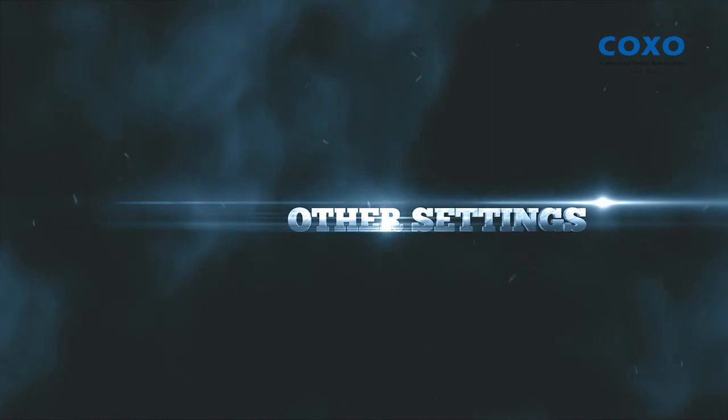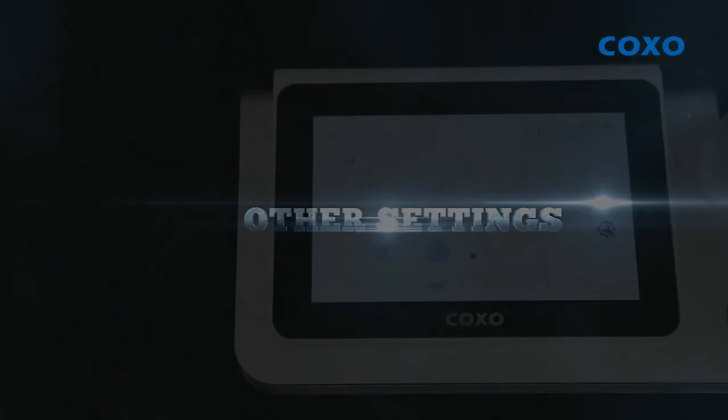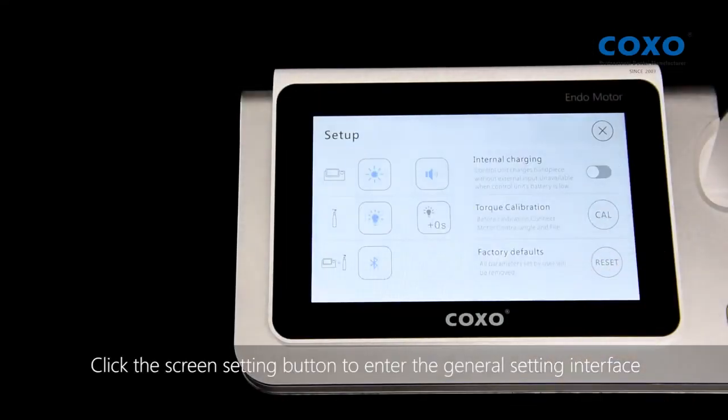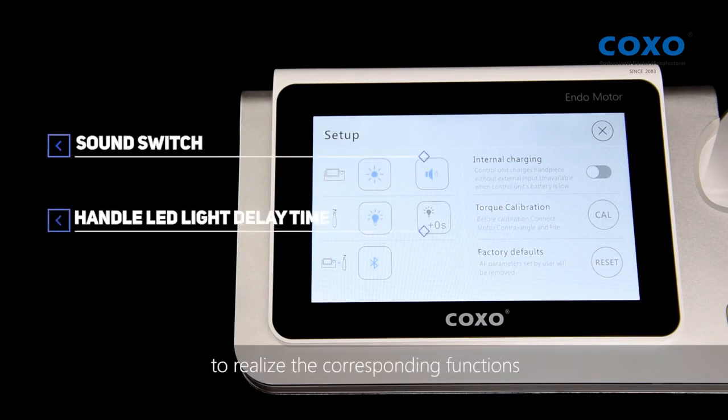Other Settings. Click the screen setting button to enter the general setting interface. Click the different buttons on the setting interface to realize the corresponding functions.